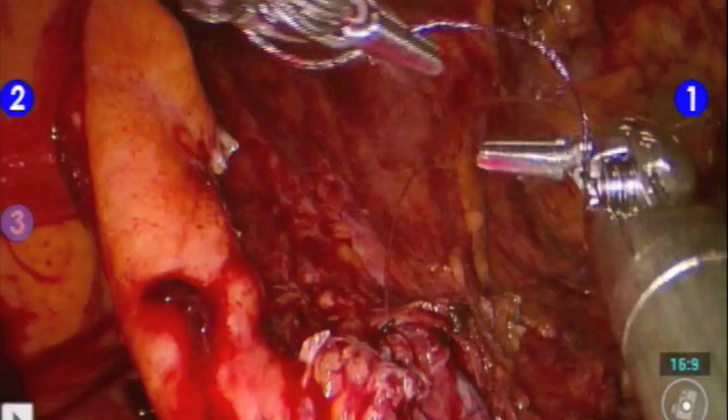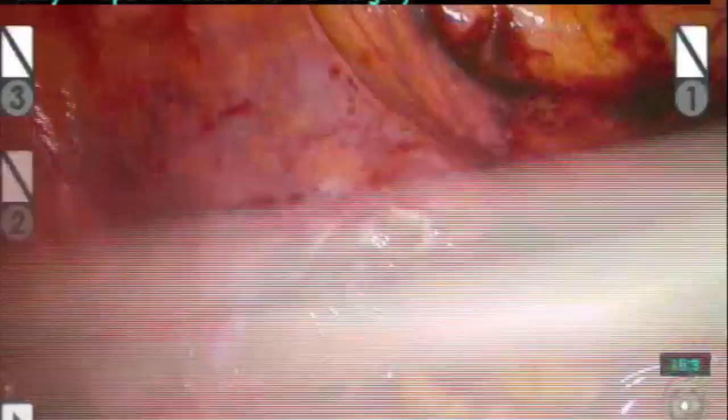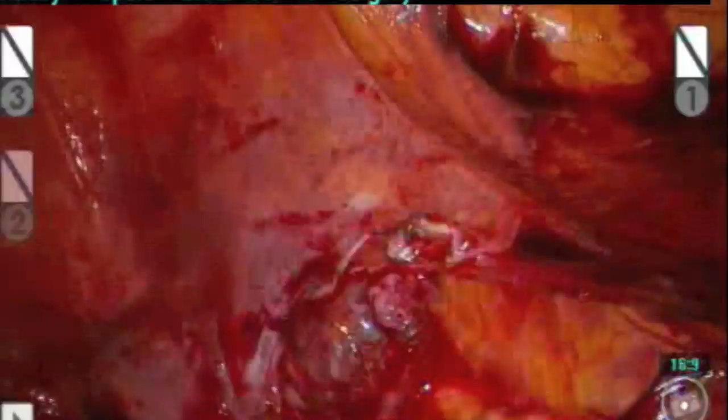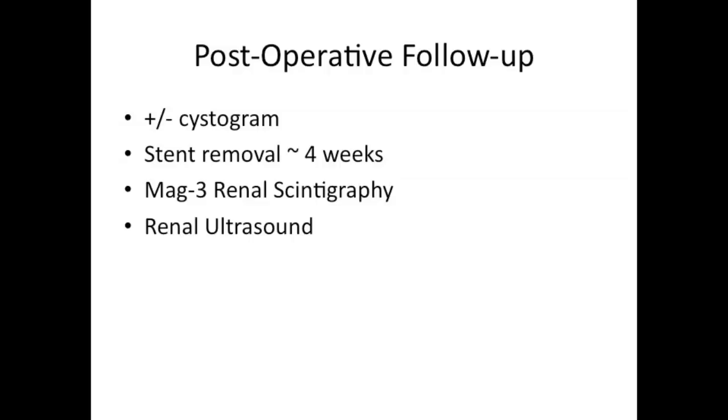After the anastomosis is completed and tied securely, a JP drain is passed through the working ports and placed into the pelvis. Postoperative follow-up includes Foley removal with or without a cystogram depending on the surgeon at one week, stent removal at four weeks, MAG-3 renal scintigraphy at about three months, and then ultrasounds to follow.